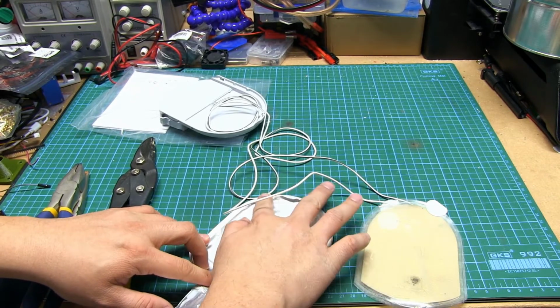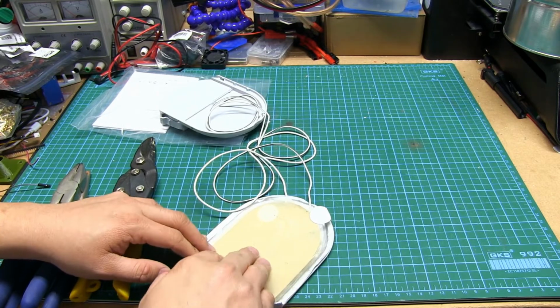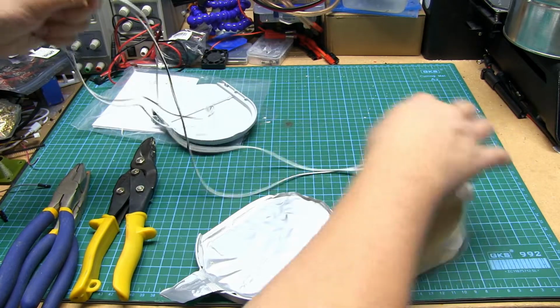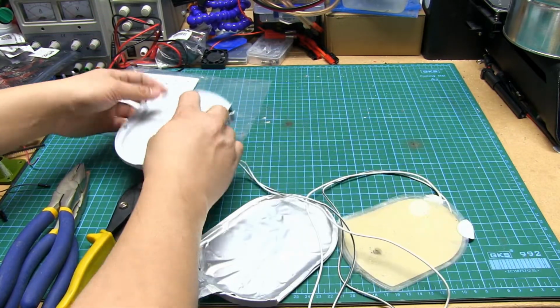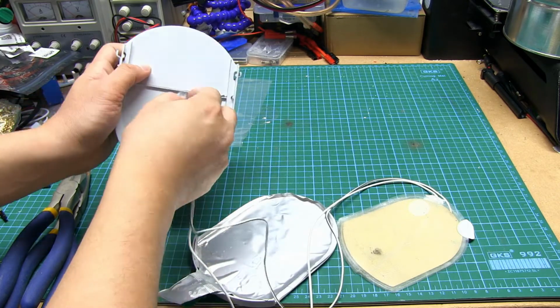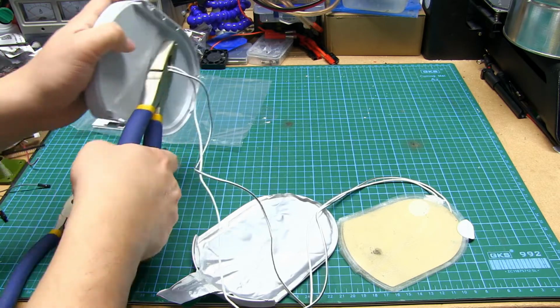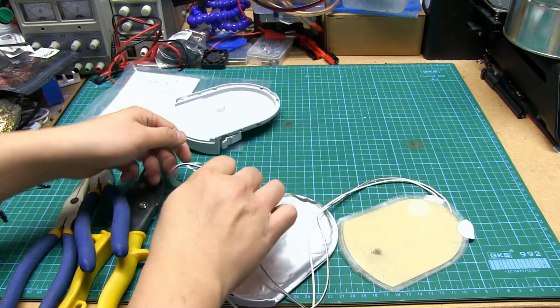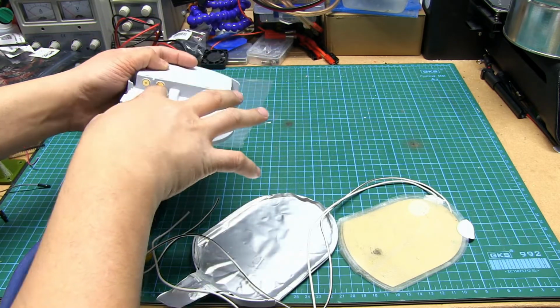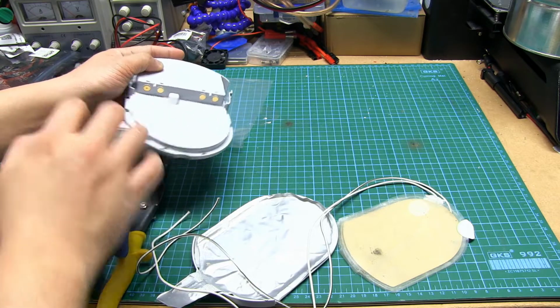This pouch is heat-sealed at the factory, so these pads aren't exposed to potentially cause any bacterial growth, etc. The wires themselves feel like they're silicone. There's a healthy amount of wire provided, and then they just terminate with a little bit of hot glue here. We don't need those, so we're just going to dike them off now. And those, I did do continuity checks before. These do just terminate at these two terminals here. These are the batteries, these are the terminals for the pads.